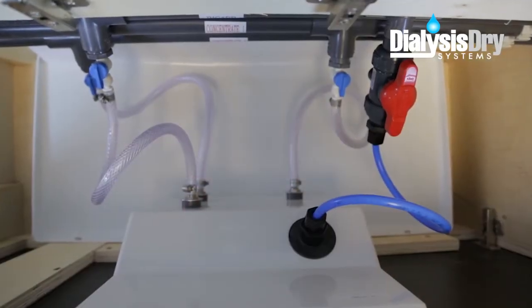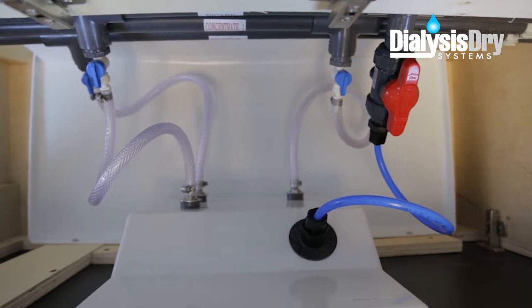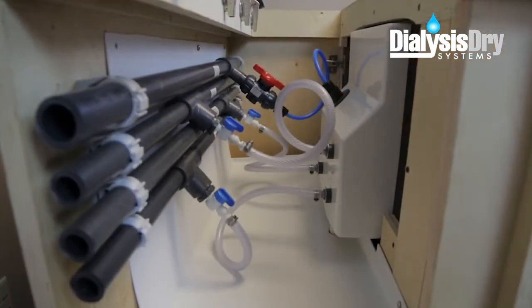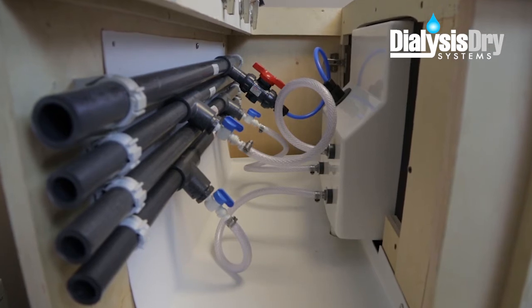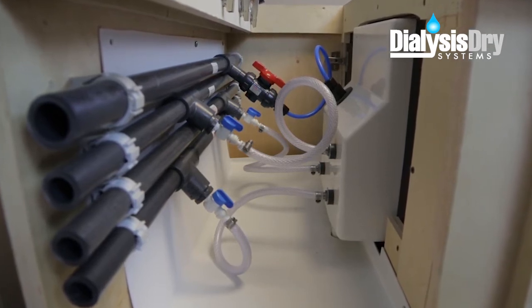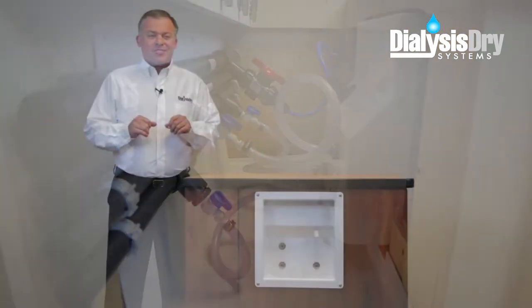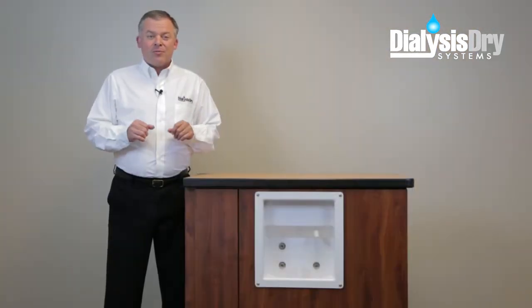Our system includes the exclusive DDS interceptor tray that extends across the cabinet interior, covering all the essential connection points where a leak could possibly begin. And when this happens, the DDS tray catches and drains these liquids into the existing drainage system, keeping the floor of your treatment areas clean, safe and dry.